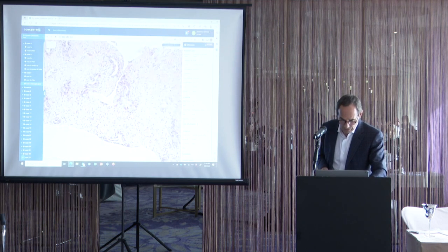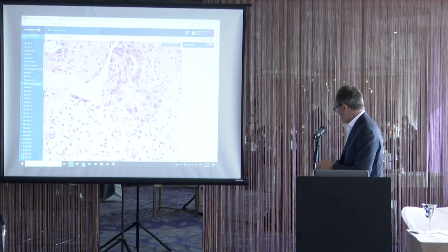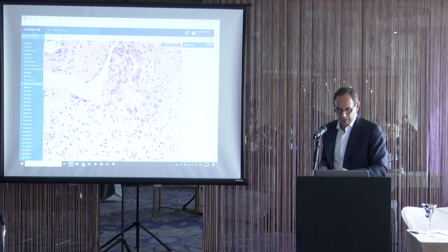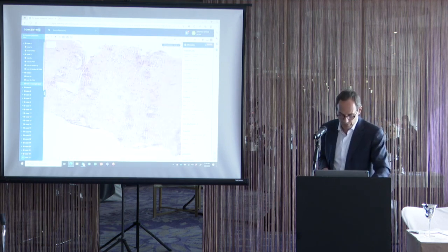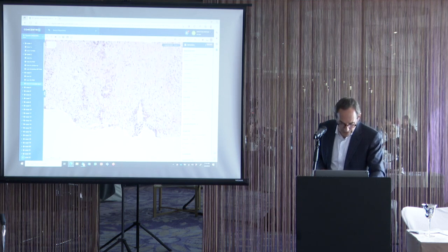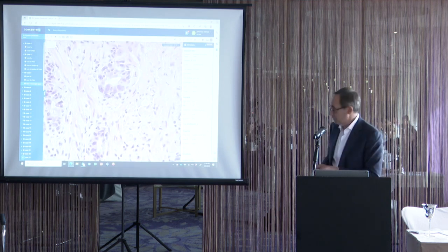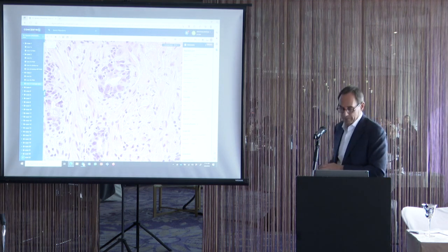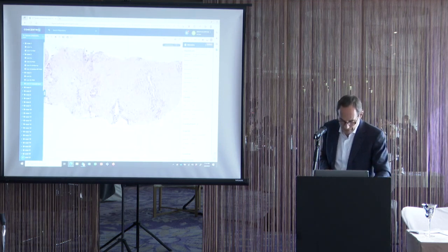You just move it around. So, for example, here you can see many of these glands are multi-layered. Also, in the same gland that you see big nuclei, you'll see small nuclei, so there's variable size, whereas prostate cancer tends to be more uniformly all atypical. So again, here are the big atypical nuclei, and in the same glands are small nuclei, some with nucleoli, but some smudgy. That's characteristic radiation effect.